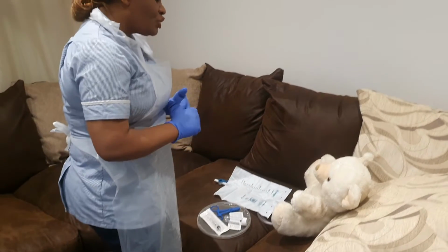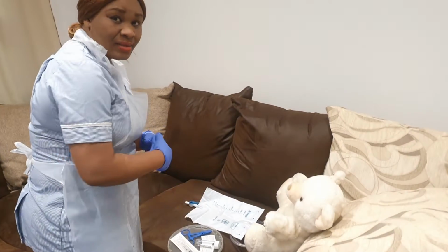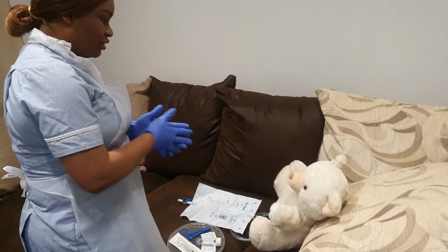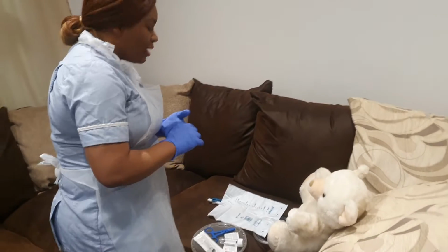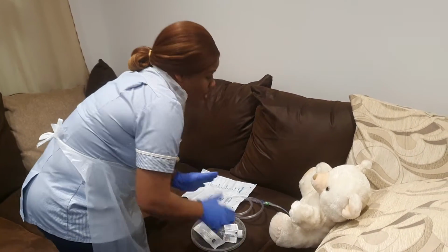So, Haley, I'm just going to be collecting a sample from your catheter. Is that okay? Mavi, can you say it's okay? Is that okay? Yeah, it's okay. Lovely. So I'll be clamping your catheter now, all right? So I'll be exposing you.